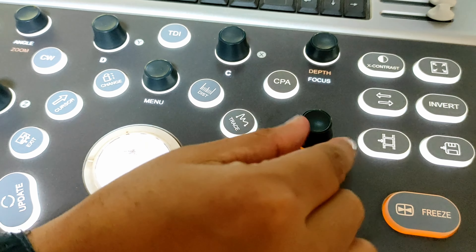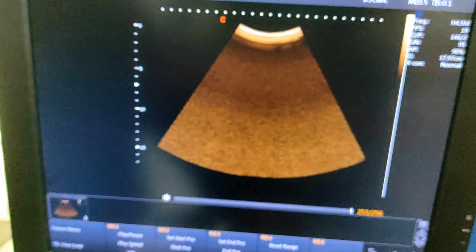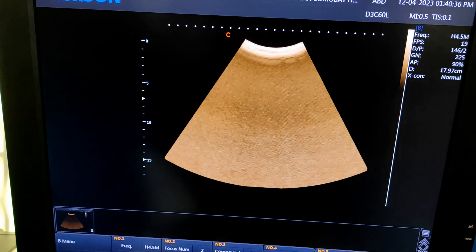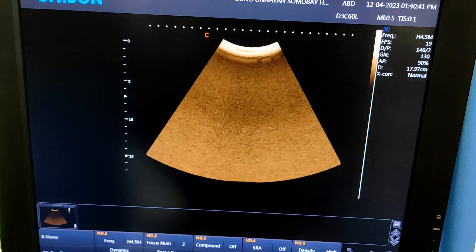This one is used to increase or decrease the brightness of your image. Now rotate the brightness button and see.